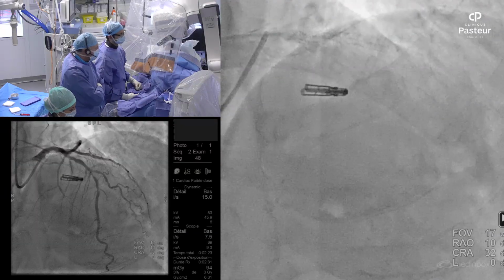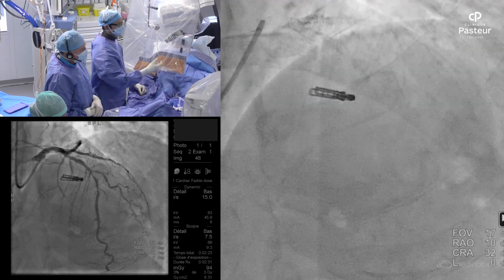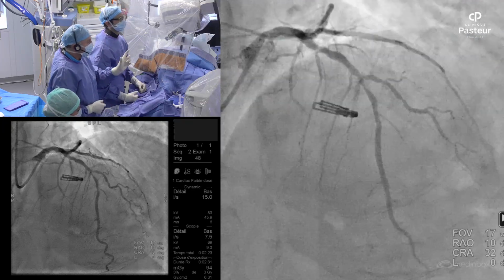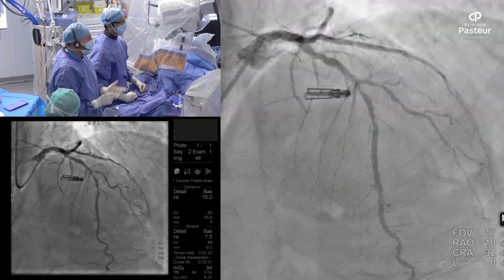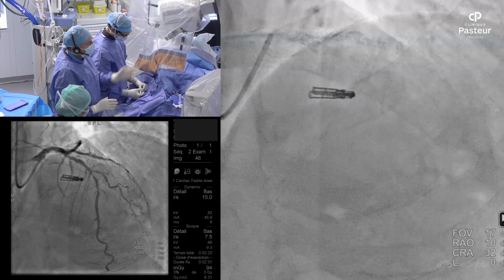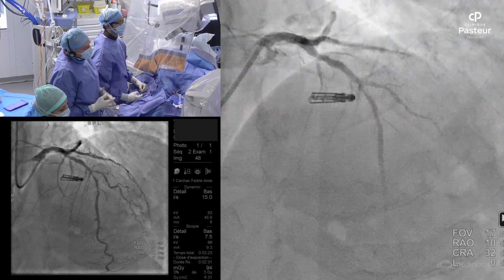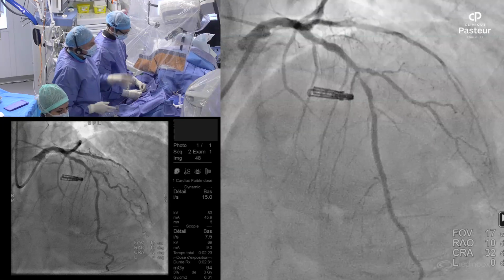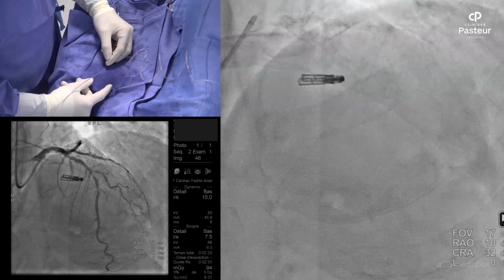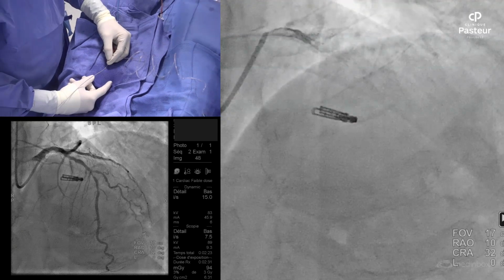Okay. Bruno, Benjamin, why do you choose rotablation instead of shockwave? Well, I think that you raise a very good comment. Shockwave could be done effectively because it's quite a large lesion. The limitation maybe is the length of the lesion, but it's not too long. I would say that maybe it will require 2 or 3 deliveries at different steps. The only problem is that in our center, we evaluate the shockwave in a trial. It's not available on the market for the moment. And in the trial, we cannot treat a bifurcation lesion, except if we do not touch the diagonal. Because it's quite a large diagonal, we do not consider the shockwave. But effectively, for this specific lesion, shockwave could also be a good solution, especially if the patient has some LV dysfunction, because with the shockwave, we are away from complications like no reflow. So effectively, shockwave could be a good alternative here.